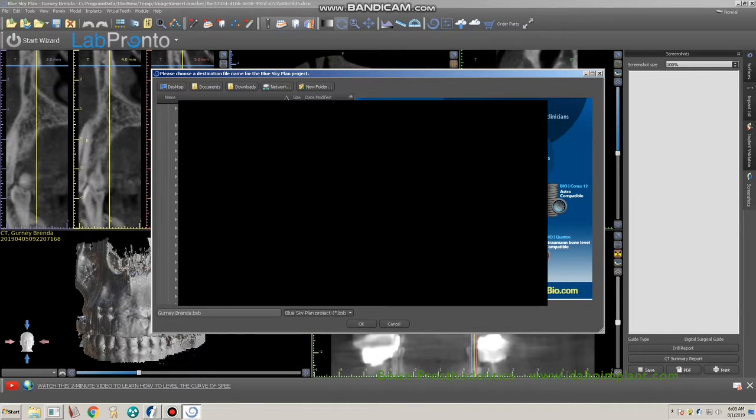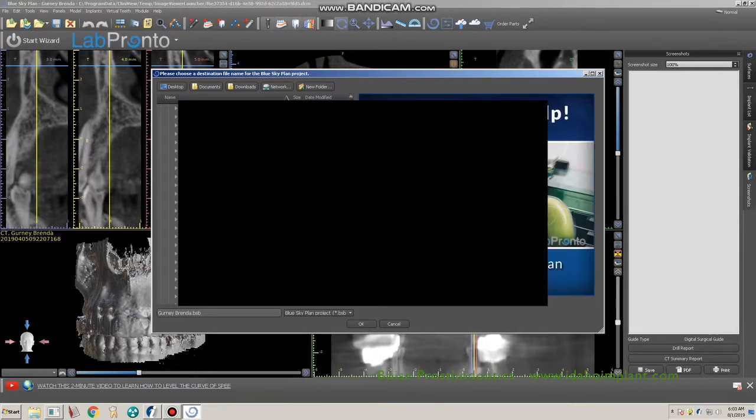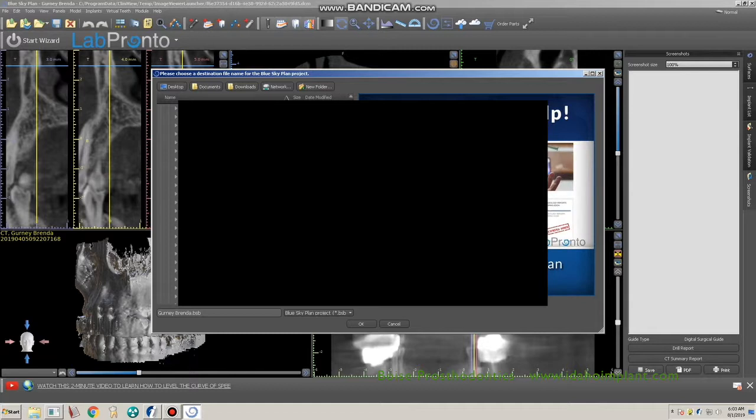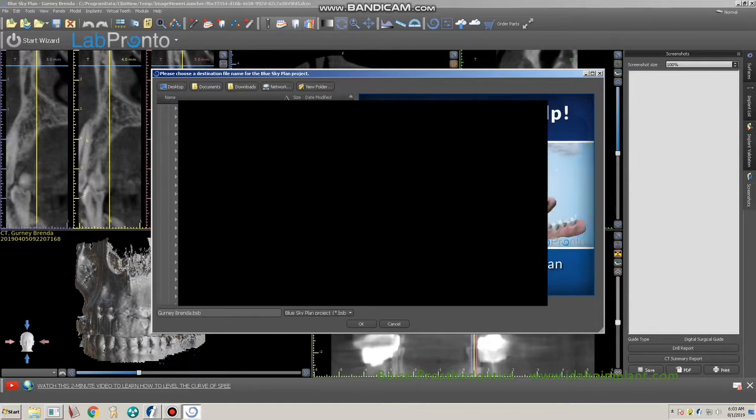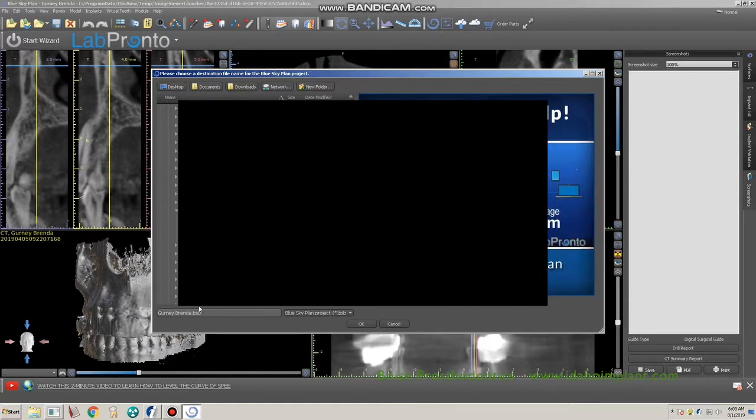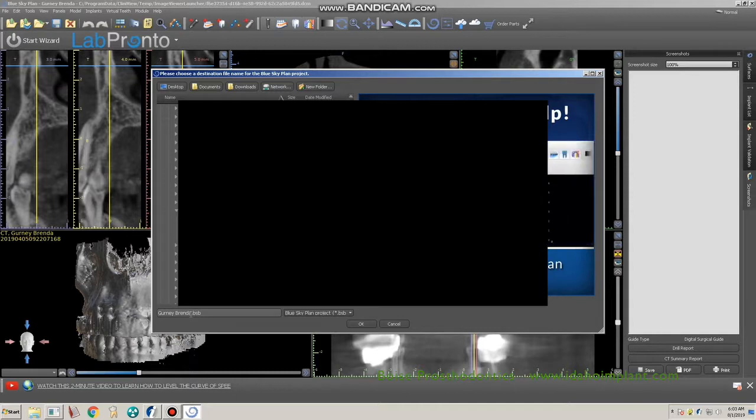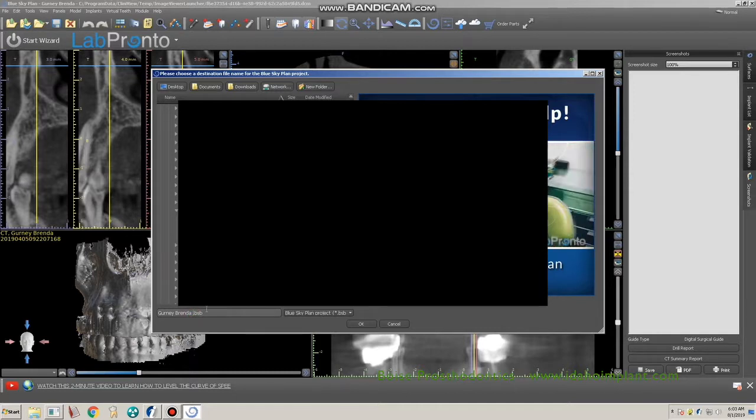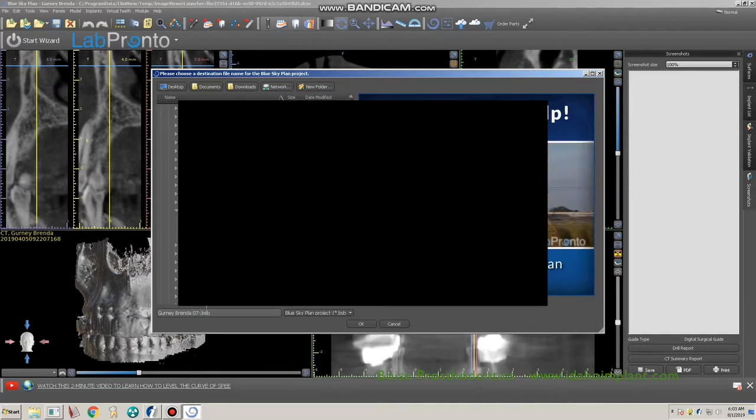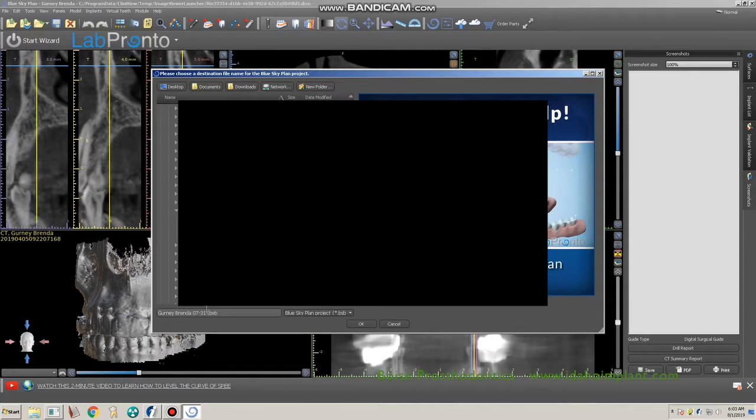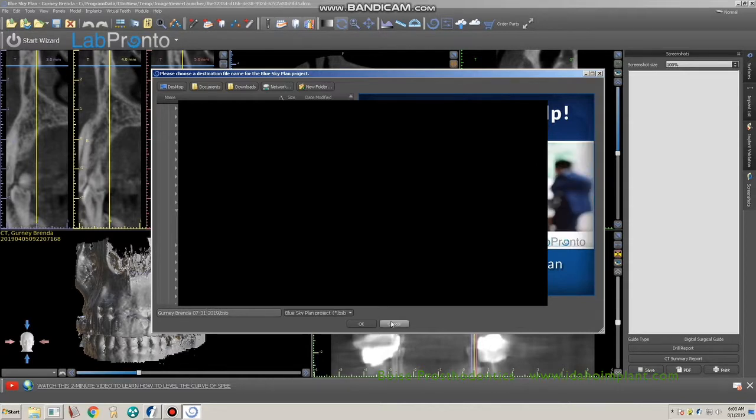In our case, we look in our patient files, find the appropriate one, and save that file into their folder. We usually place a date on the file so that we don't get it confused.